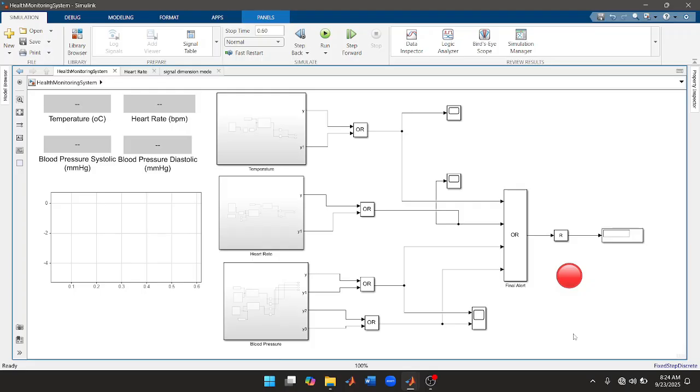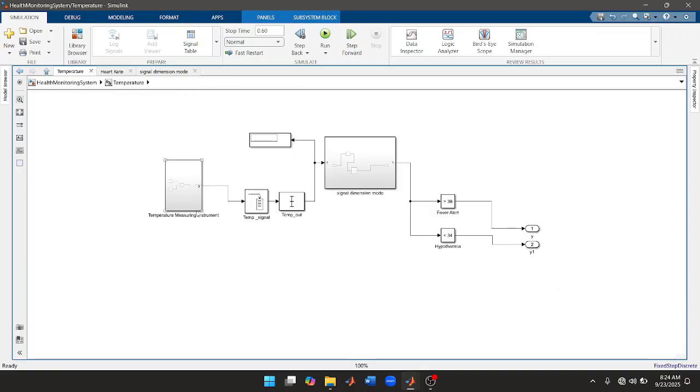The patient is in danger. Now, these are vital signs that are usually measured for many patients in health clinics, majorly ICU. So, for the temperature, we have the temperature measurement equipment and then the output buffer. This temperature is programmed to measure a higher temperature and a lower temperature.